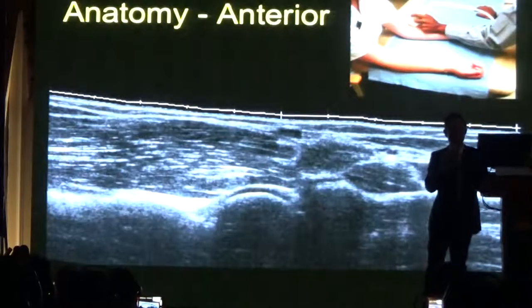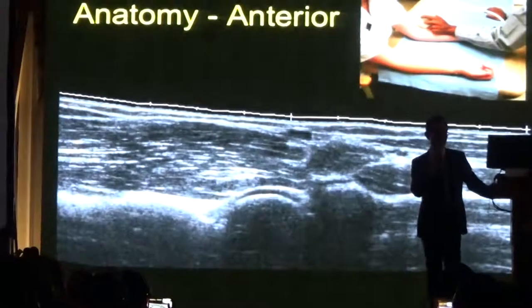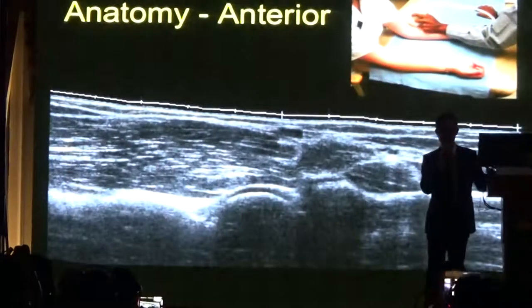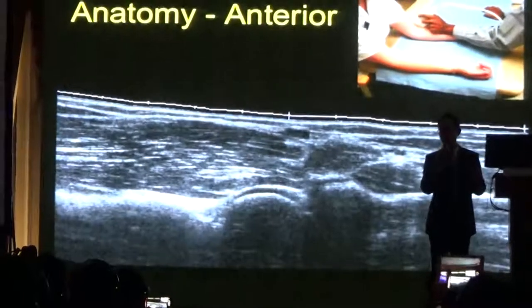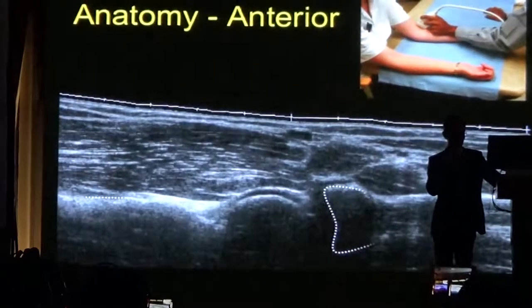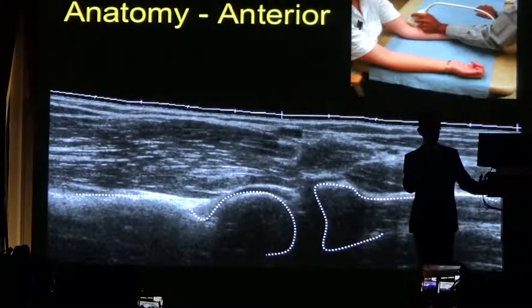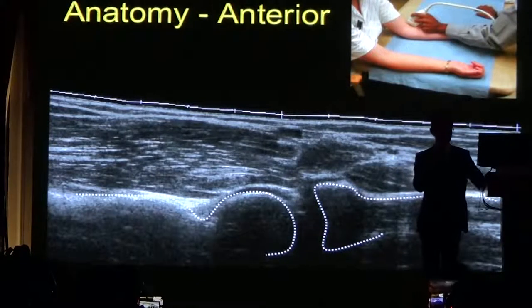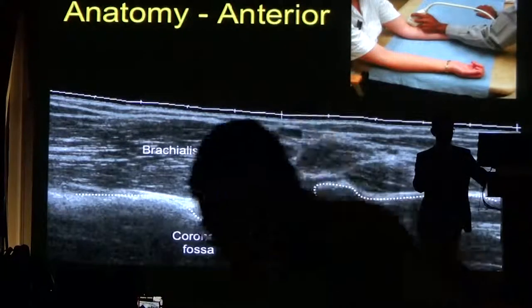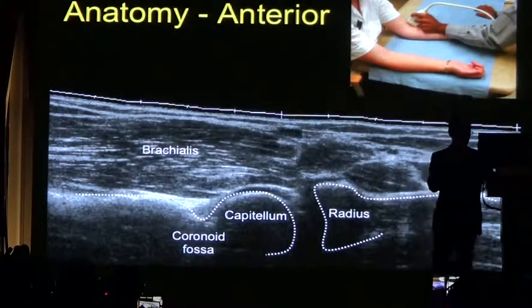To examine the elbow joint anteriorly, what we want to see is the radial capitella joint as our first landmark — that's the easiest place to orientate yourself when looking at the elbow. This is an extended field of view image. You can see the humerus on the left side of the image with the radial head and the proximal radius, and the radial capitella joint.